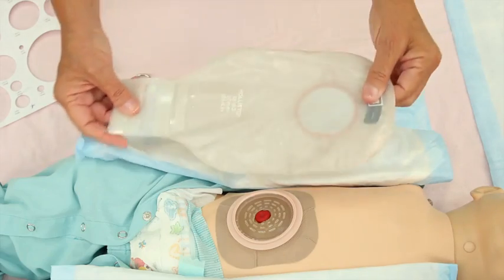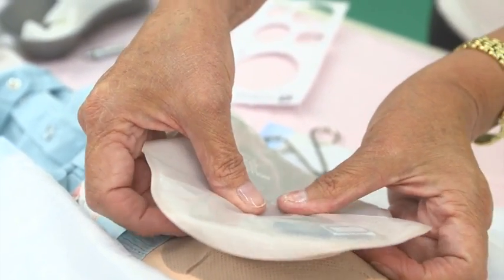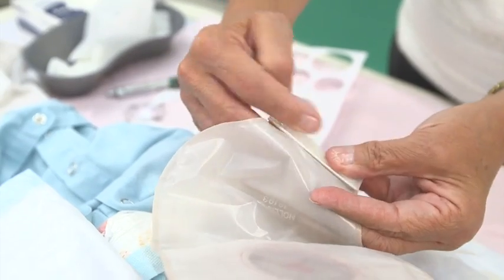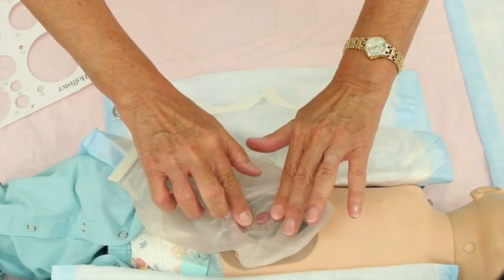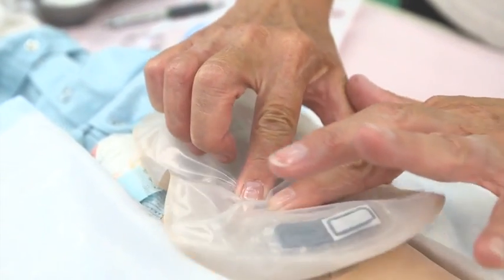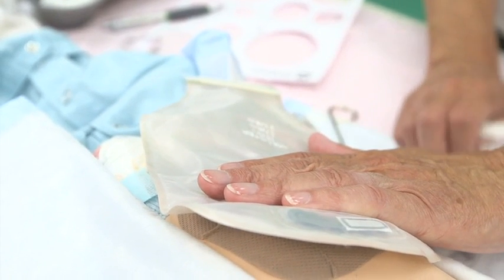Attach the pouch to the skin barrier. They snap together like Tupperware using your thumb and index finger. Close the end of the pouch. Lay your hand over the ostomy appliance to help warm the products to improve adherence. If your child will lay flat for several minutes, this can also help to improve adherence.